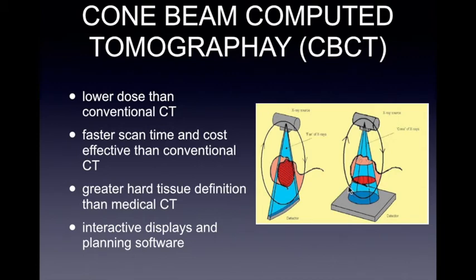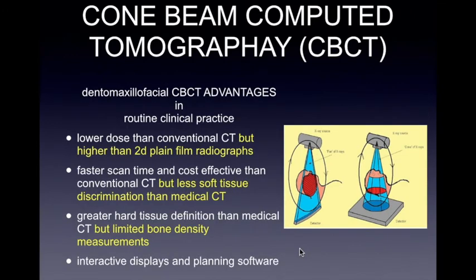Okay? Now, if this is the case, why not just simply use cone beam technology every single time? Because nothing comes without a cost. Yes, CBCTs have a faster scan time because it utilizes the entire cone beam as compared to using just one specific line of the X-ray radiation produced as the detector gets it, but it comes also at a cost.